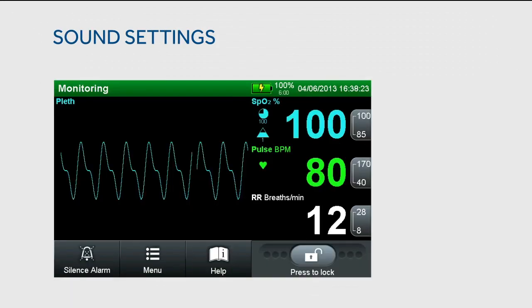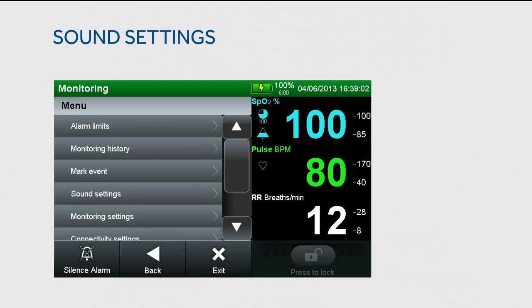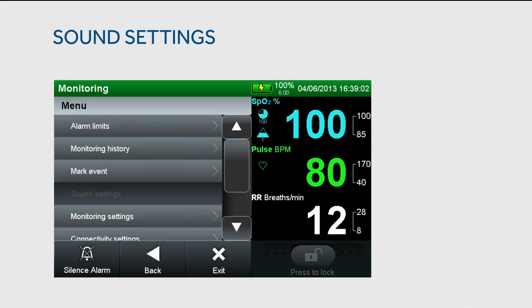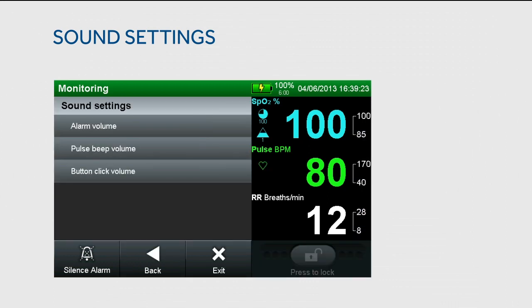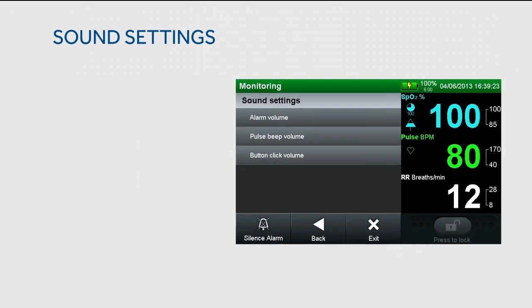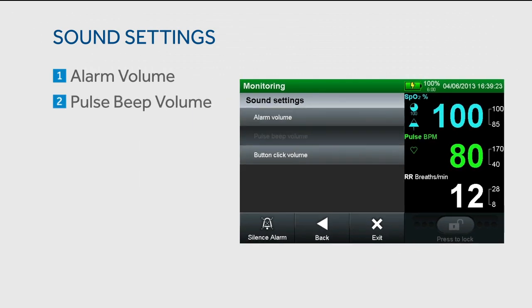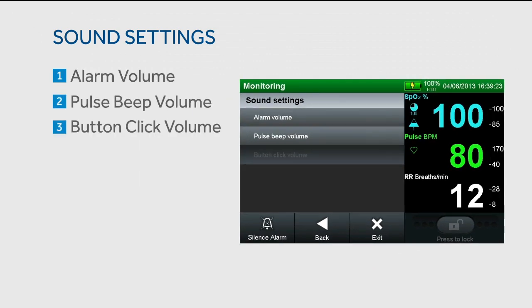To access sound settings, touch menu and the sound settings submenu. From here, you can modify alarm, pulse beep, and button click volume.